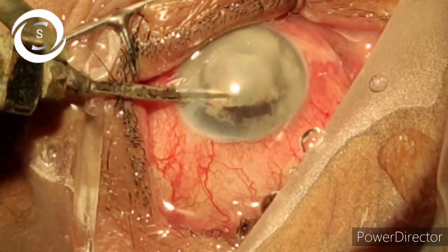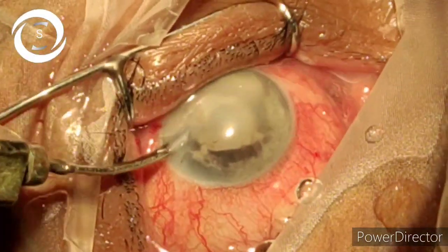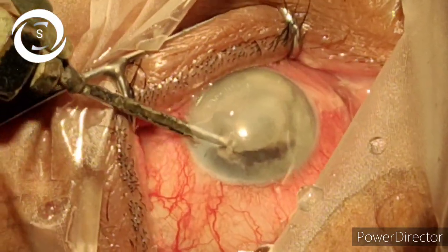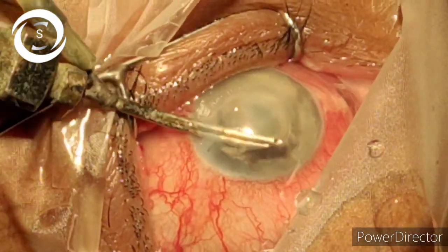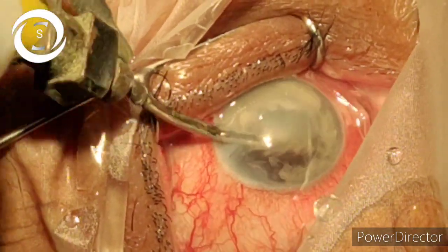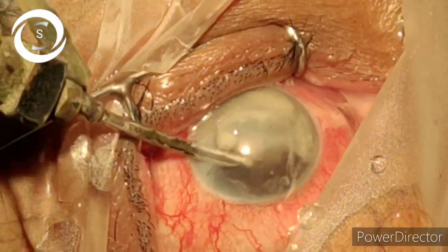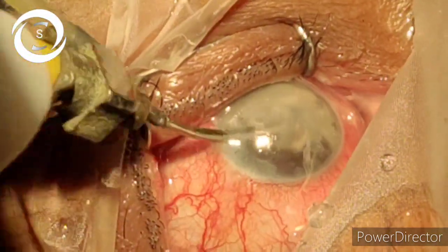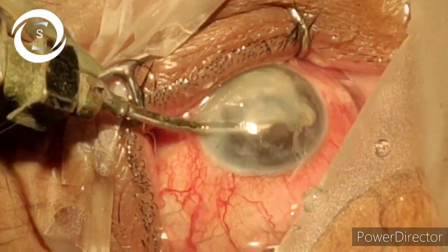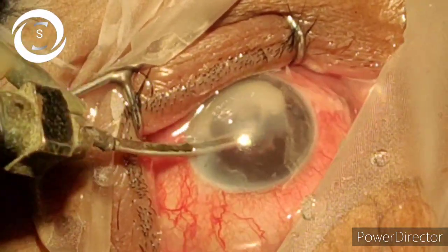When I observed the case under the microscope, I realized that the ulcer is not that extensive, but actually the anterior chamber is filled with a lot of pus and exudates. So I decided to perform anterior chamber paracentesis and wash. Now you can see that under topical anesthesia I made a port.